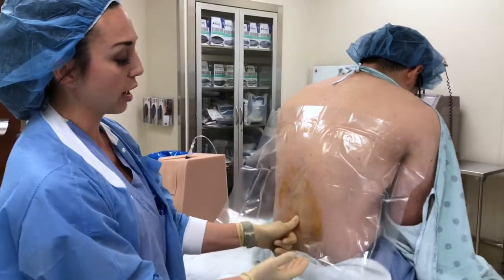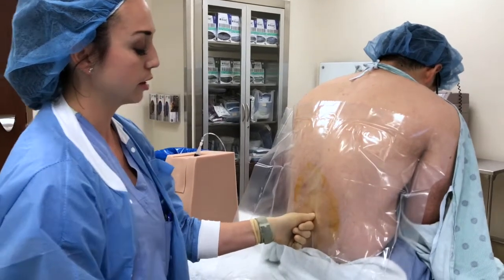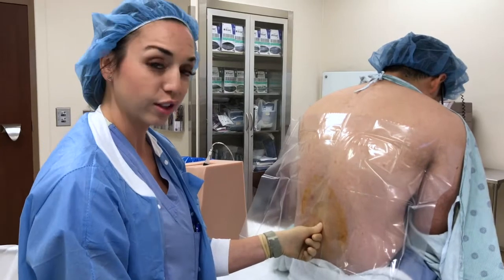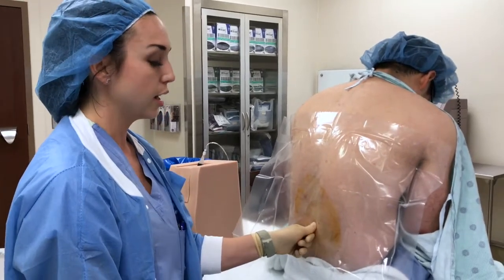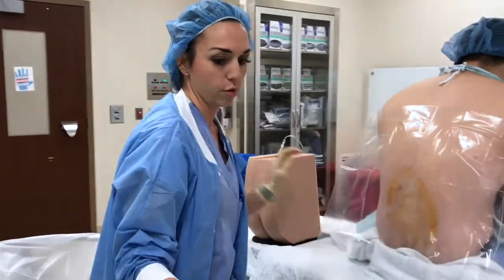So in this patient, I would proceed to inject my local right here. Some people make a thumb dent to remind themselves. And obviously before you inject the local, be sure to inform your patient. So this time I'm going to move over to our standardized patient, Dr. Butts, over here for the remainder of the procedure.